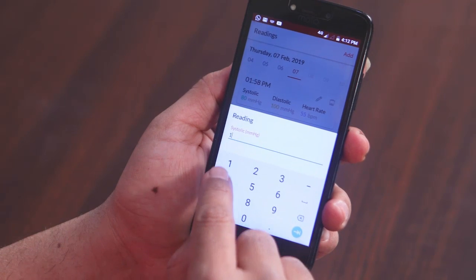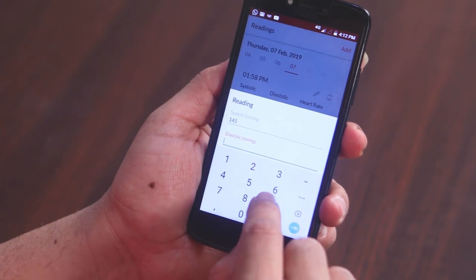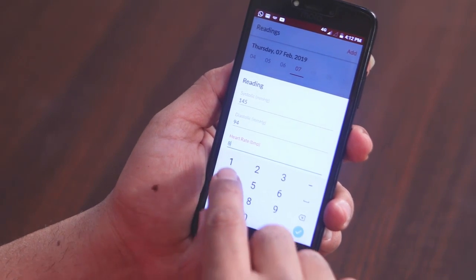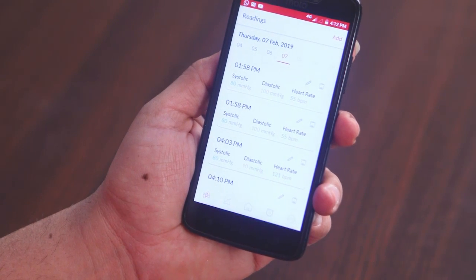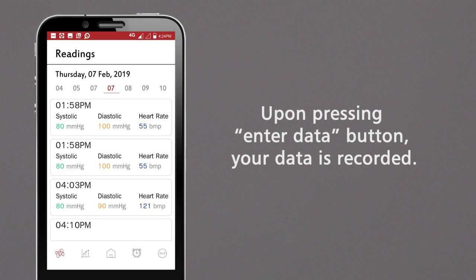Enter your systolic blood pressure in the first field, diastolic blood pressure in the second field, and heart rate in the third field. Once you have entered the correct data, press the Enter Data button. Upon pressing Enter Data, your data is recorded.